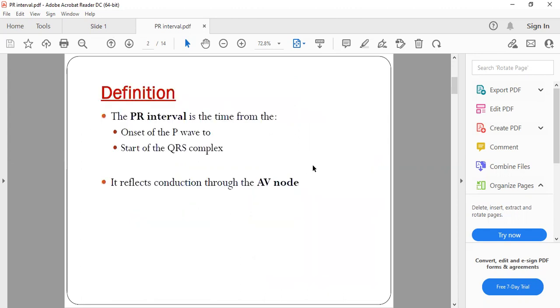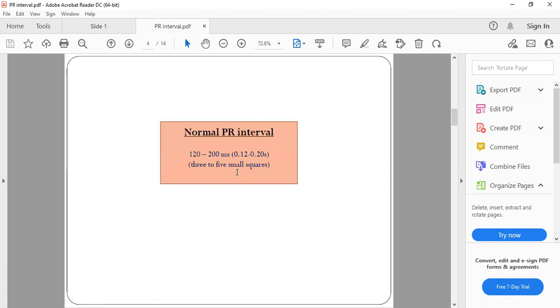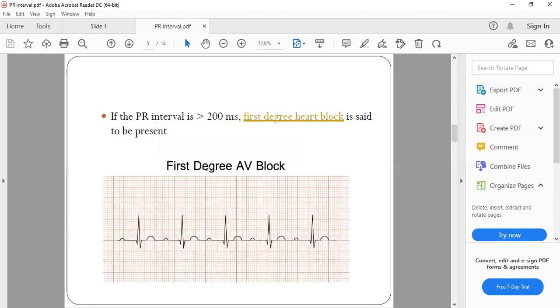So it reflects conduction through the AV node. The interval is from the beginning of the P wave to the beginning of the QRS complex. The normal PR interval is around 120 to 200 milliseconds. Each small square is 40 milliseconds, so the normal PR interval should be within 3 to 5 small squares, or less than 1 big square.